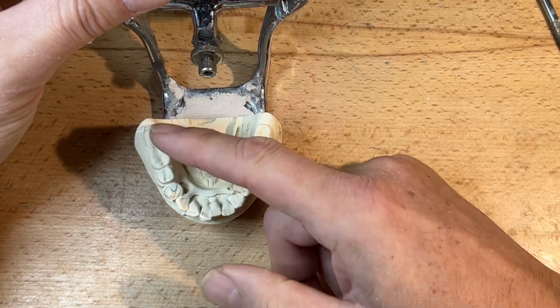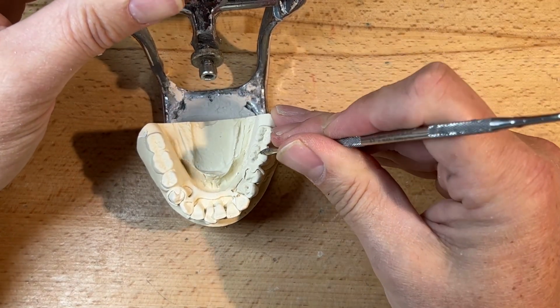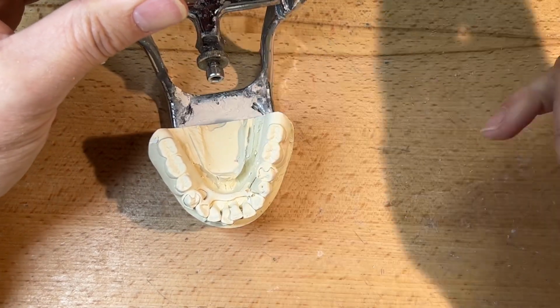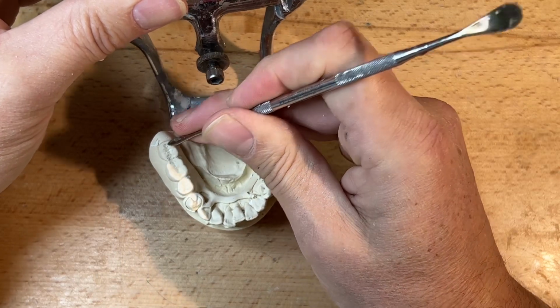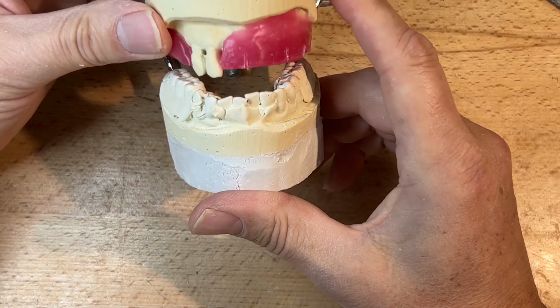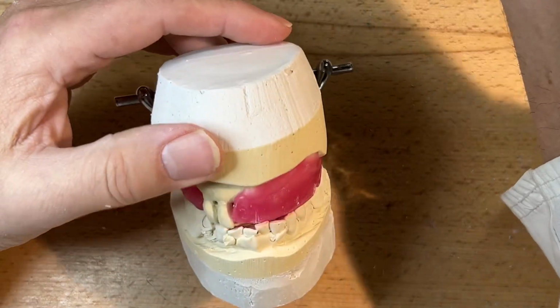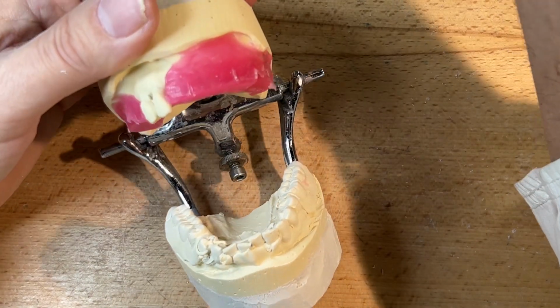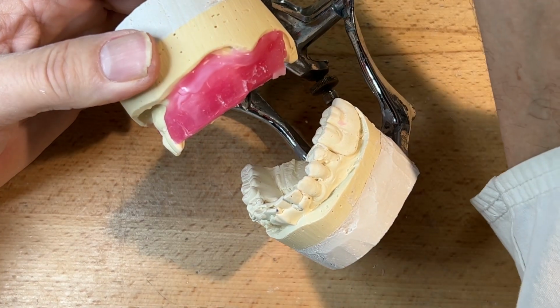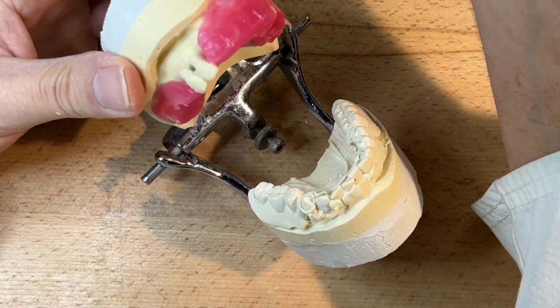with the Kennedy Class 1 bilateral free end RPD. So we can take this bubble out here on the lower. And it looks like these are some semi-anatomical denture teeth here on the bottom, and we're going to attempt to set this up. So I've separated the model. I'm going to seal this down because I don't want it to move while I'm setting up.